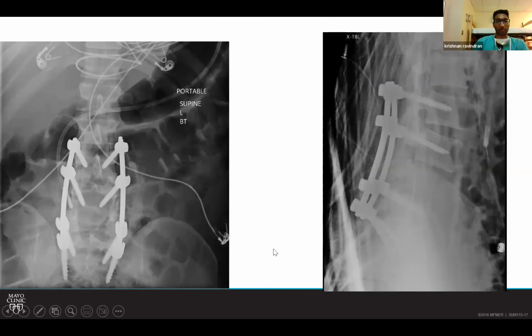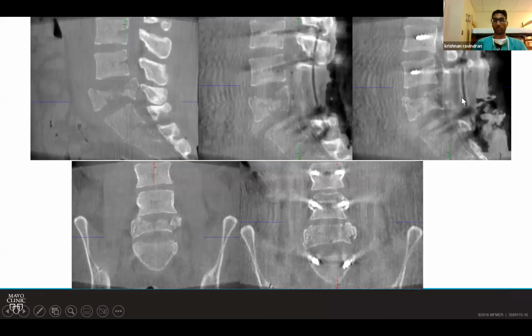So these are his postoperative films here. These screws are more anatomic than parallel to the end plate, straightforward as Dr. Abodi or other attendings like them. But you can see the 2 up, 2 down construct. You can see that he's still anterolisthesed at the fracture site. But overall, we were relatively pleased given the degree of reduction that we were able to obtain with this.